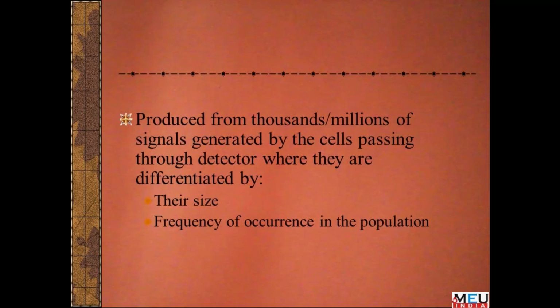Now, it is important that we correlate these histograms with the normal, and with whatever disease we are seeing otherwise, so that over a period of time we become very confident about our interpretation of these diagnoses. They are not a replacement for the actual naked eye interpretation, but they provide a flag or direction. They help us move in a certain direction.